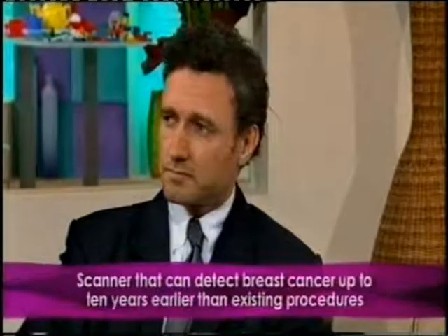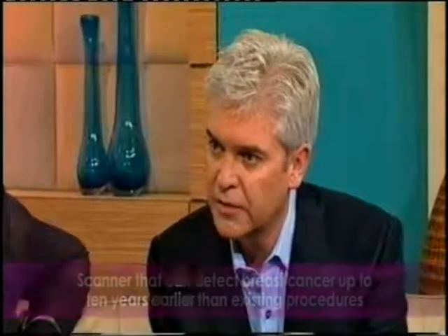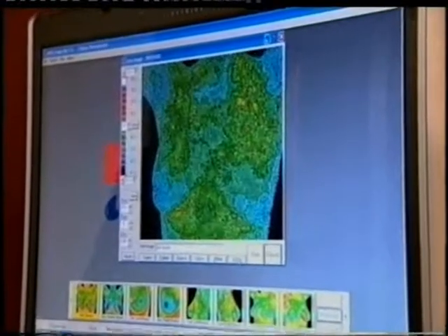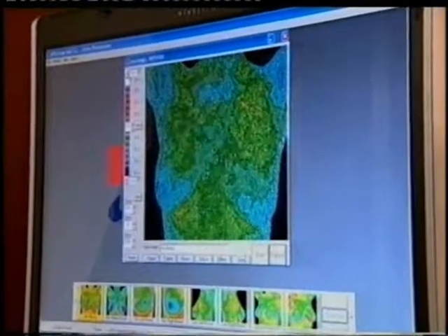Right. And so when you see the results on the computer, what do the results actually look like? What can you see? Well, I have an example of a normal scan on my computer now. Here's an example that you can see on the screen. You're seeing different colours basically, and each one of those colours represents a different temperature. This is a normal-looking scan. Normally, heat would show as red, as you'd expect, or hot, and cool would be blue. Each one of those colours represents a particular temperature. The sensitivity of this equipment is down to 0.03 degrees centigrade. So that's how precise we can be in temperature differences.